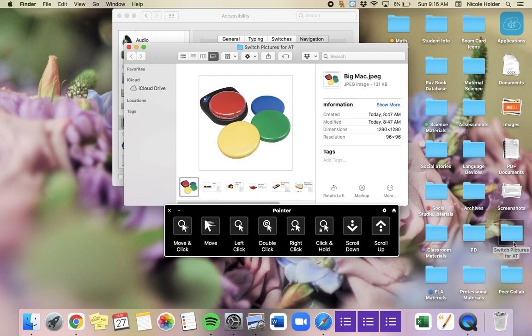We would give him more. Very basic. Now we've moved to, I'm hungry, I'm thirsty. He would select food for when he wanted a snack, and he would select thirsty for when he wanted water. And now we've switched him back to Proloquo, which has a scanning feature.